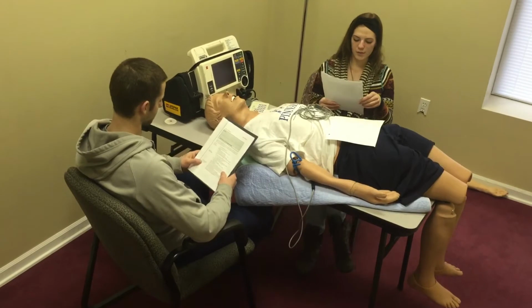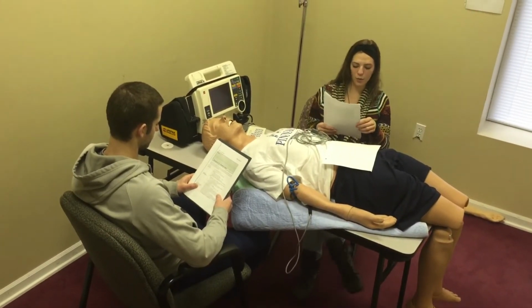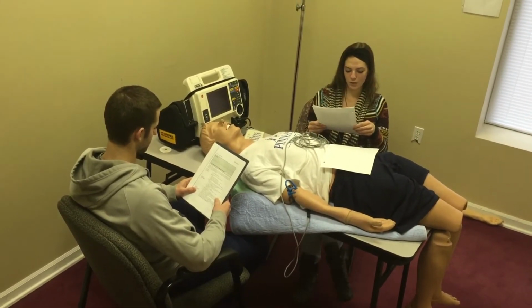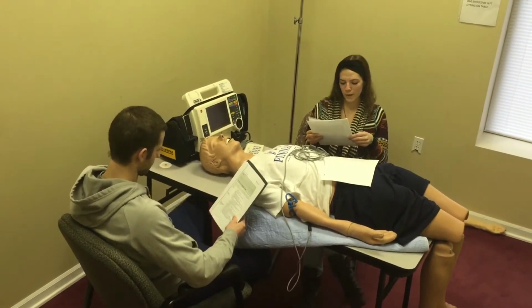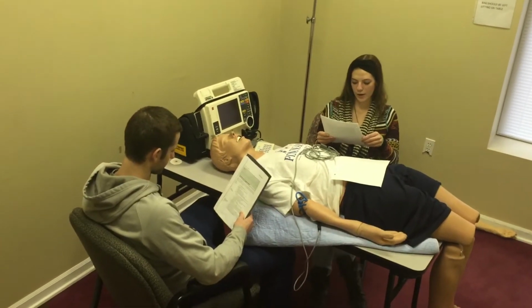Patient with the above rhythm is a 56-year-old man who complained of significant chest pain and palpitations before calling 911. At this time, he is confused and lethargic with the following vital signs: blood pressure 80/40, pulse rate corresponds to the EKG rhythm, 180 and irregular. Respirations are 22 breaths per minute with normal tidal volume. So this is AFib and it's an unstable, irregular, narrow complex tachycardia.